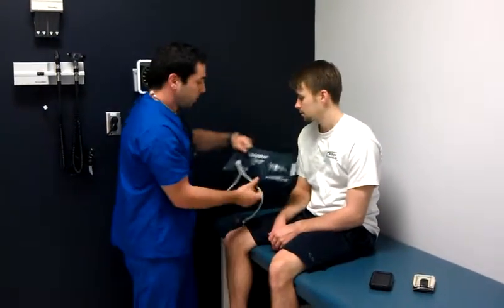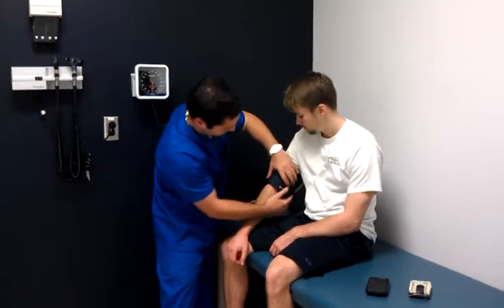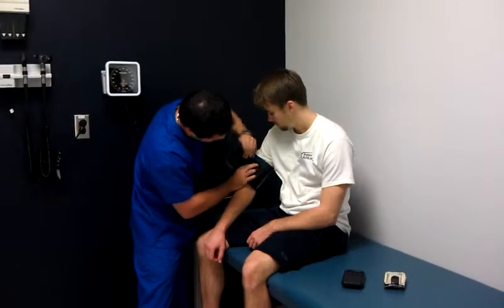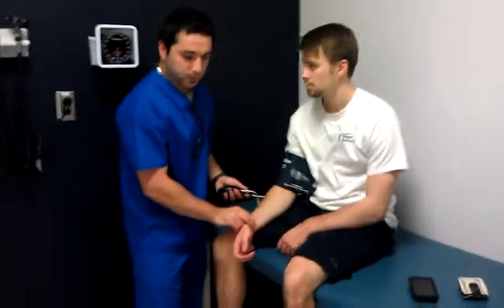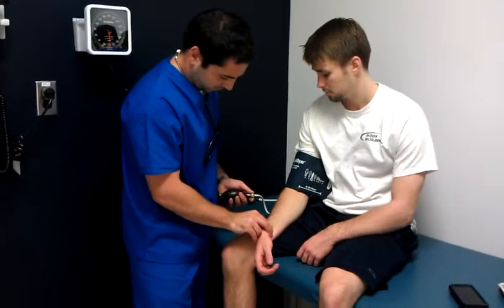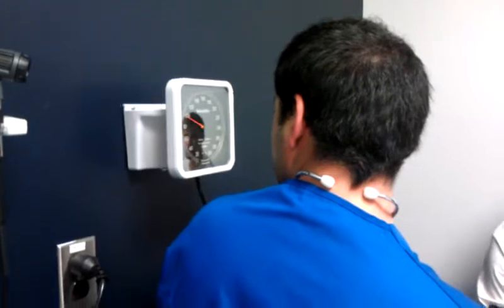Take the blood pressure cuff, apply it around the patient's arm. Find his radial pulse and feel for when the pulse fades. Note the number.